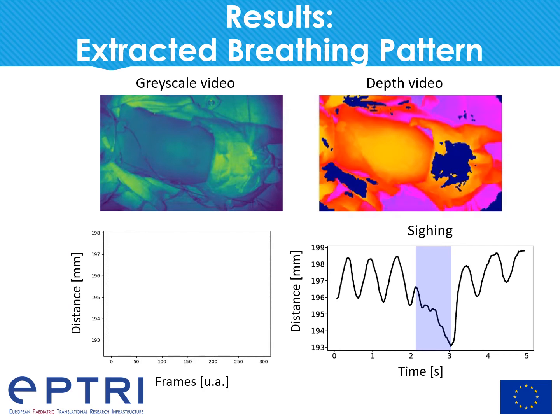From the movement data, we also extracted various breathing patterns. In a moment, I will show you recordings of the abdominal movement from one of the preterm neonates. At the top, you see the preterm neonate breathing. The left video is a grayscale video, and the right one is a depth video. The lower left video will show you the extracted breathing movement over time, and the lower right, the extracted breathing pattern from the starter. The y-axis is again the distance between the neonate and the camera, and the x-axis the time in seconds, or rather the recorded frames.